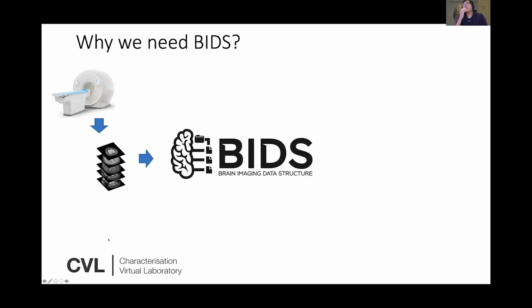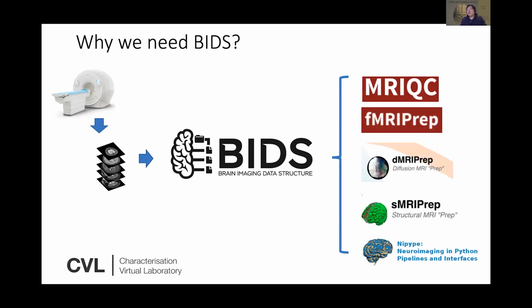Firstly, I want to touch on why we want BIDS, from an imaging processor's and researcher's point of view. As we know, from the scanners you get DICOMs, and then you convert them into BIDS. I always make this comparison: BIDS is like a key, so it can open other doors. The doors mean all of these powerful pipelines, and also the big community behind it. Once we have the data in the proper format, we can do a lot of things.